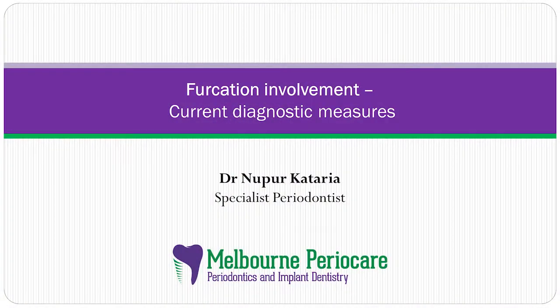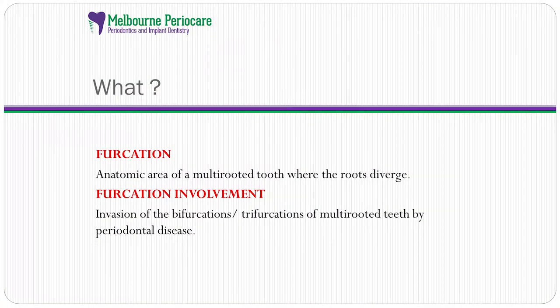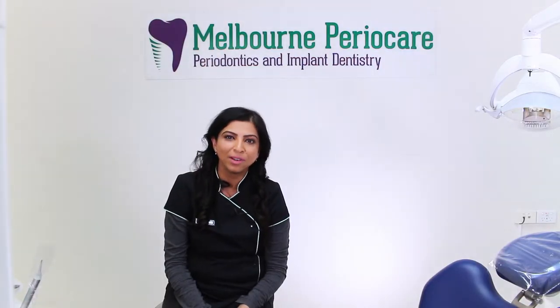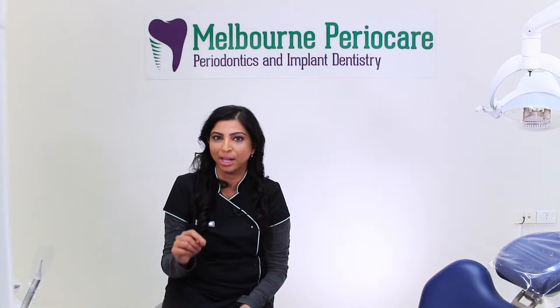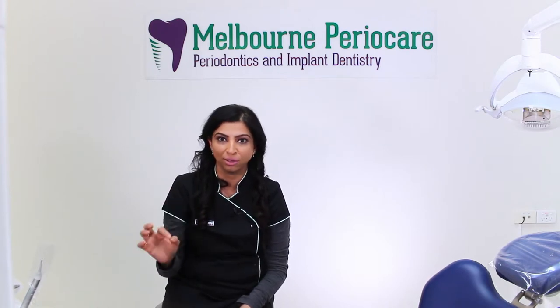Today's topic is furcation involvement, the current diagnostic measures. We know that furcation involvement is the invasion of bifurcation and trifurcation of multi-rooted teeth by periodontal disease. Diagnosis of furcation involvement on any day could be a challenge for a periodontist or a dentist. It's very, very difficult sometimes to pick up these particular defects. However, with the right modality, we can actually detect furcation involvement quite well.